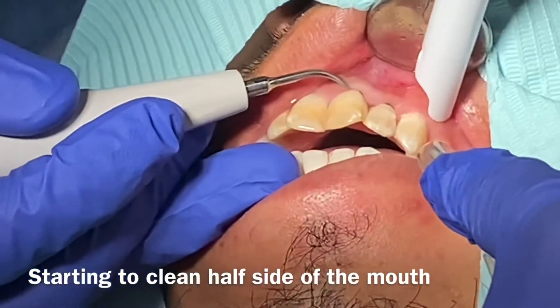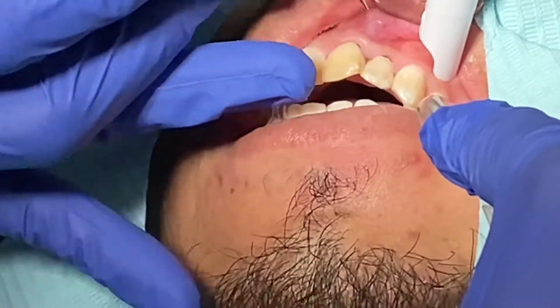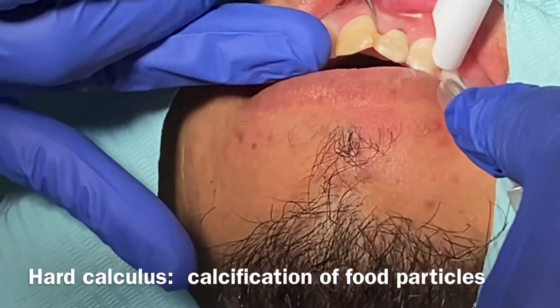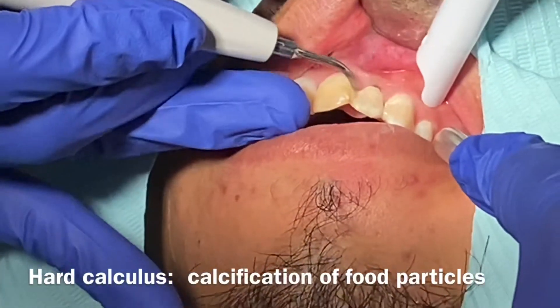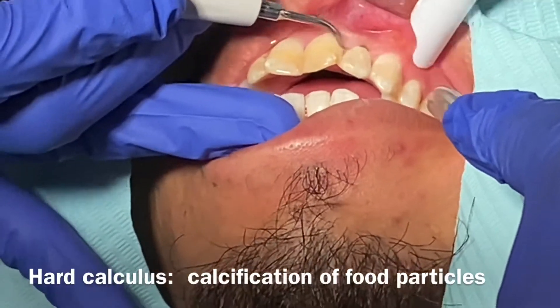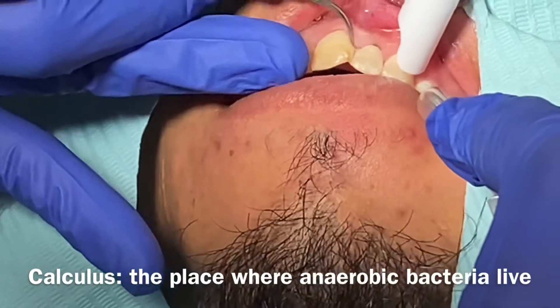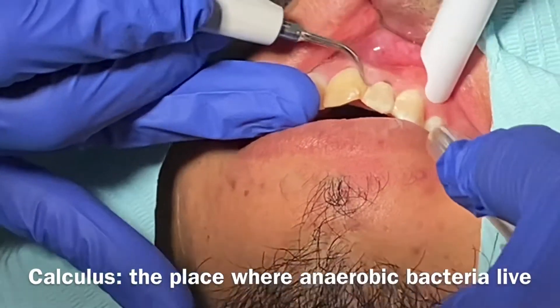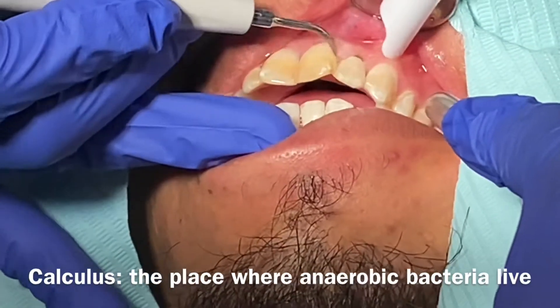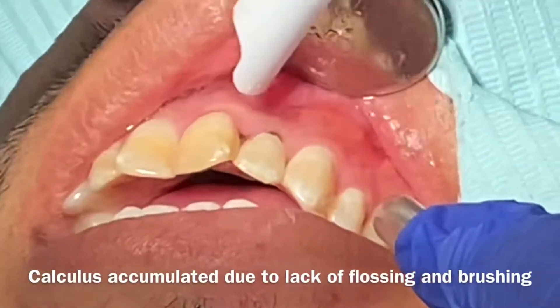You can see the calculus being removed. I'm using a water pressure Cavitron — the water shoots and breaks apart that tartar and calculus that has been stuck between your teeth for so many years. This contains bacteria. I'm speaking to both dental assistants and dental hygienists who are beginning to learn, as well as to patients — this video is just general information. I'm not trying to teach everything, just trying to demonstrate for everyone.